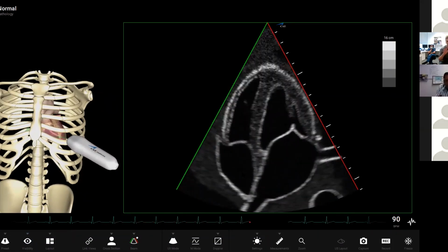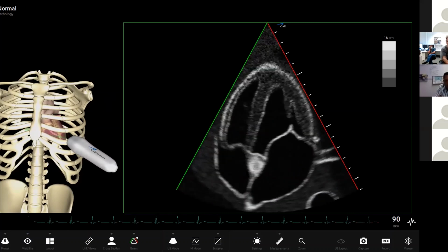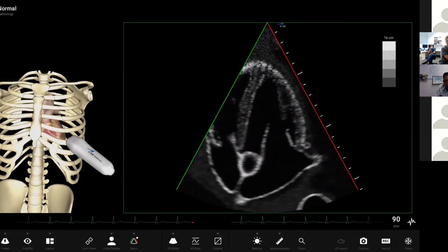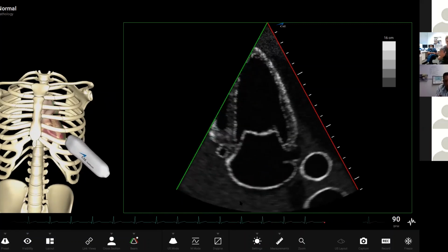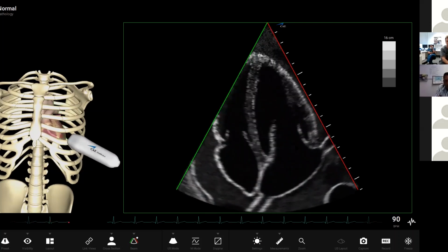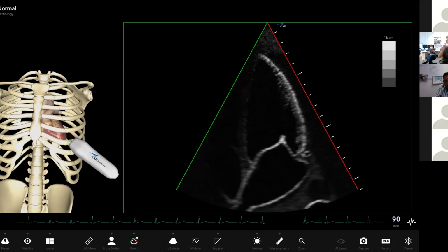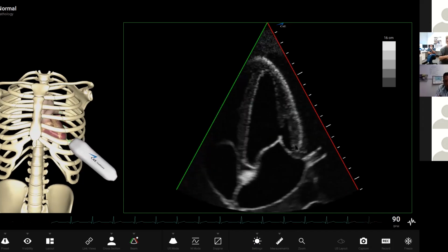And that's great for 2D pictures, and we need to have that. If we want to try and get the two-chamber view, we put the left ventricle into the middle of the screen, and we rotate around 90 degrees. I'm sure you all know about that, until we lose that right ventricle. Cool. So Doppler, let's talk about Doppler. This is the angle that we're going to be able to get the best views for cardiac output, for LV inflow views, for diastology, for all the rest of it.